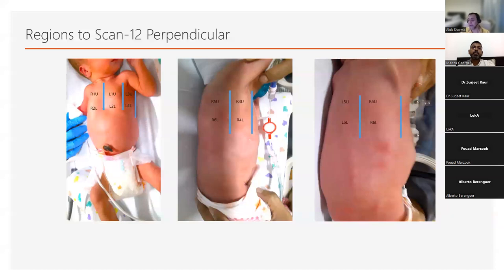So I'll come to that. My advice to you is we should use standardized terminology. For the purposes of this course, my advice would be use the 12-region method and classify them as R1, R2, R3, R4, L1, L2, L3, L4. And for the purposes of peer review, that's all I need. That's all I need at the moment.